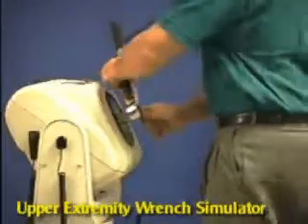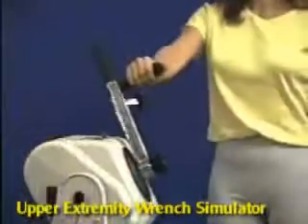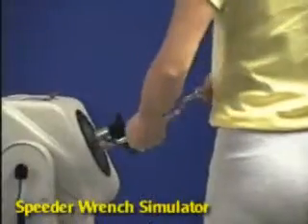For the upper extremity wrench simulator, simply install the attachment and set range of motion stops. Also, for the speeder wrench simulator, install the attachment and set range of motion stops.